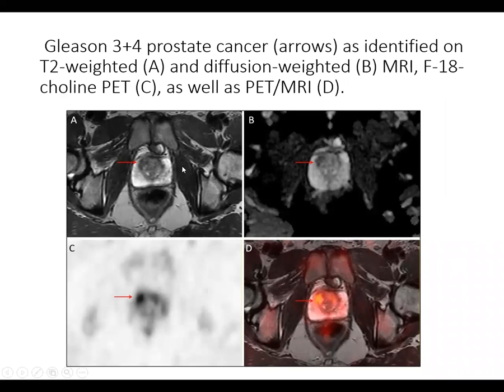This is the prostate, this is the pubic symphysis, these are the pelvis bones, this is the rectum, and the fat surrounding the prostate. This is the peripheral zone of the prostate, this is the central zone of the prostate, and the transition zone of the prostate. Here we can see the suspicious lesions, which are shown on both MRI images here and here.